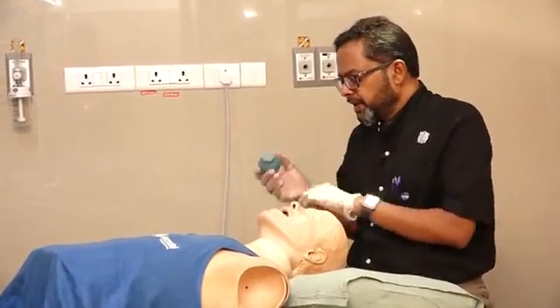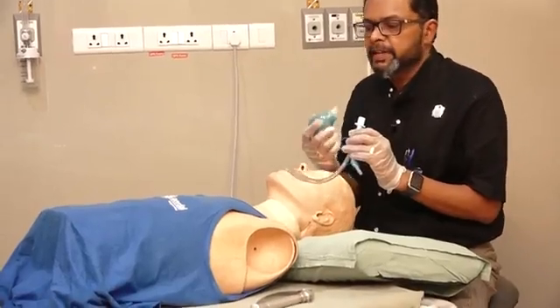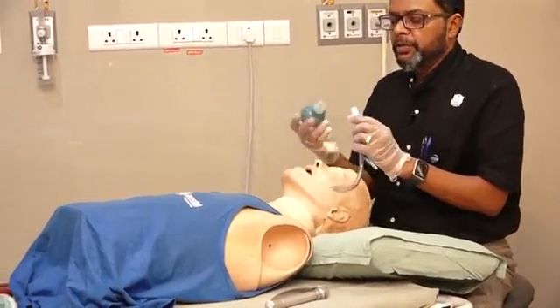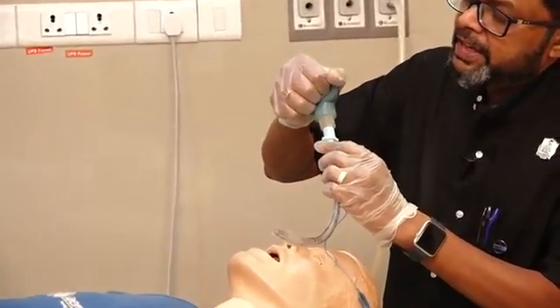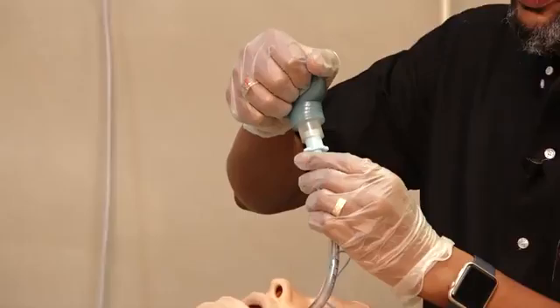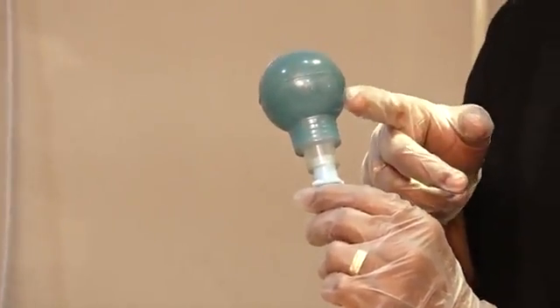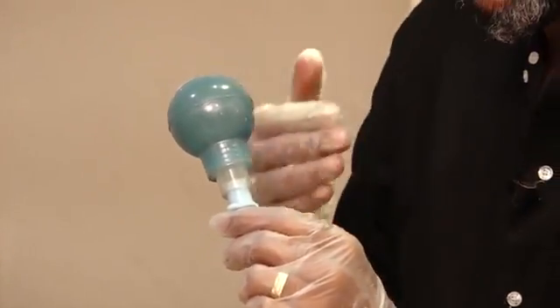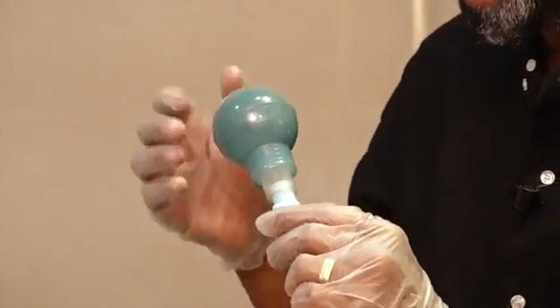After intubation, if you have any doubt whether the tube is in the esophagus or in the trachea, what you do is squeeze it like this, then attach it to the endotracheal tube, and then release it. If it reinflates within a few seconds — less than four seconds — it means the tube is in the trachea.